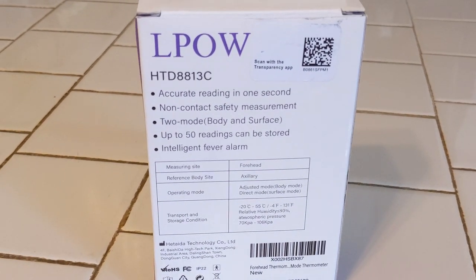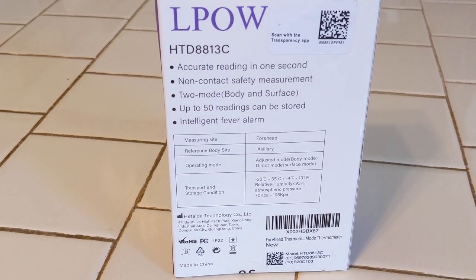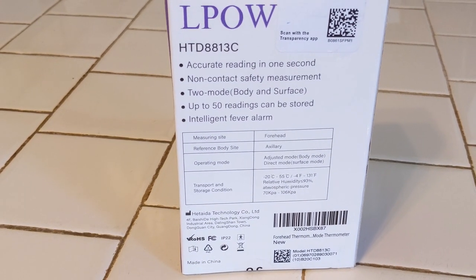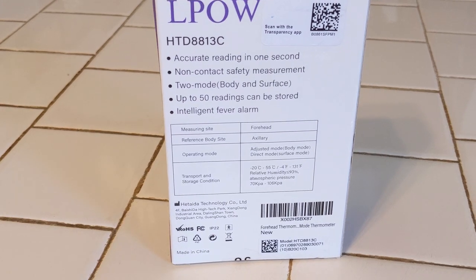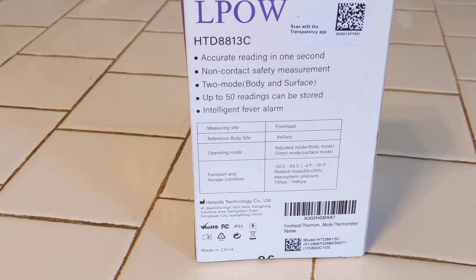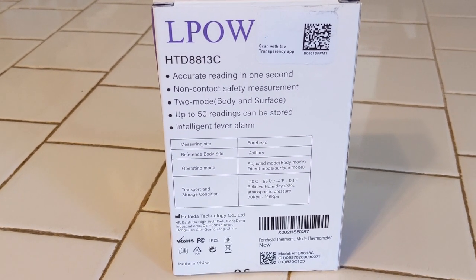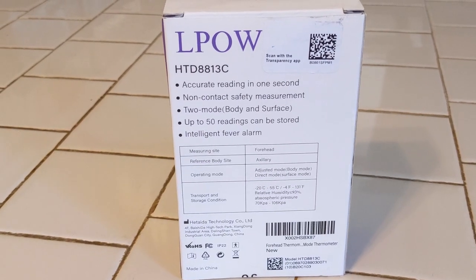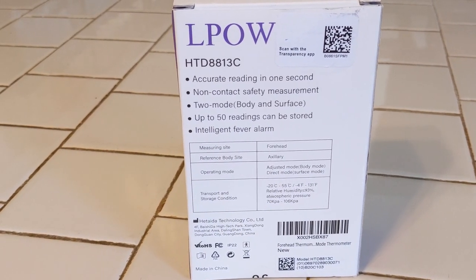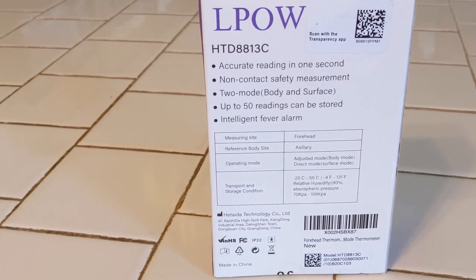Let's see if I can get it to focus a little better here. Anyway, this gives an accurate reading in one second, and it's no-contact — it's a safety measurement so you don't have to touch anybody. Two modes: body and surface. I tried this on the refrigerator — you can actually see what the temperature of your refrigerator is. Pretty cool. It has up to 50 readings that can be stored.